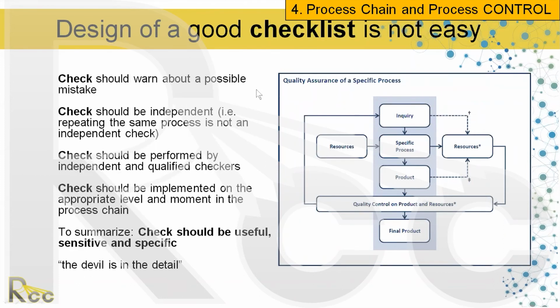And if you are implementing checklists, which is recommended, I think the Checklist Manifesto really popularized the use of checklists, but checklists have been used in highly reliable organizations for a long time. And I think in that book, he starts by talking about the improvements made by the use of a checklist in airlines and in flights.